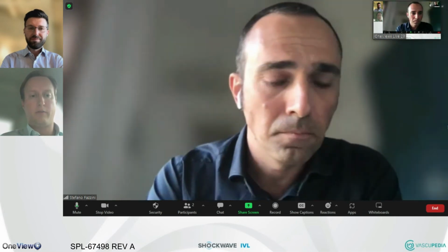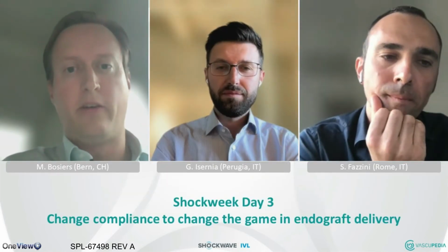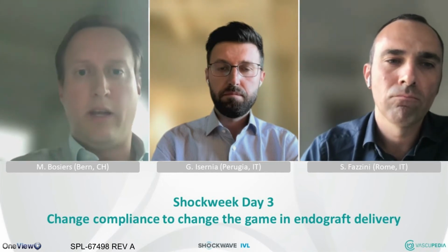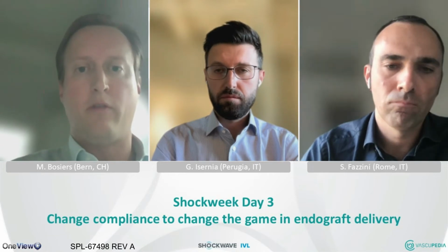Very nice case, Stefano. Thank you. You used this because this was your first experience. You used a 7 millimeter IVL catheter. Now, since January, we have the 8 millimeter available. Do you believe the 7 millimeter is enough, or will you in every case use the 8 millimeter, or does it depend on the endograft you choose?